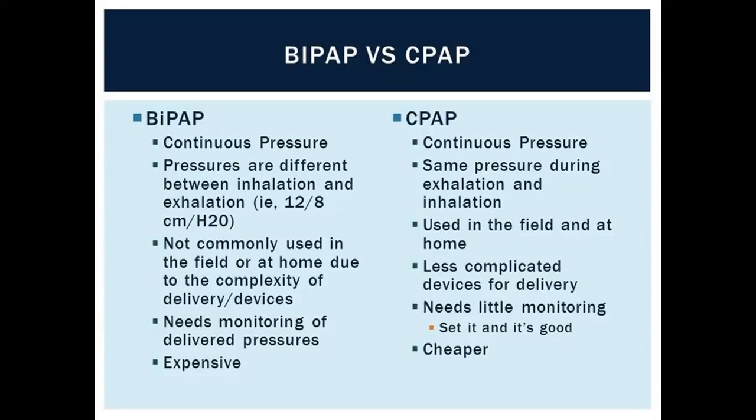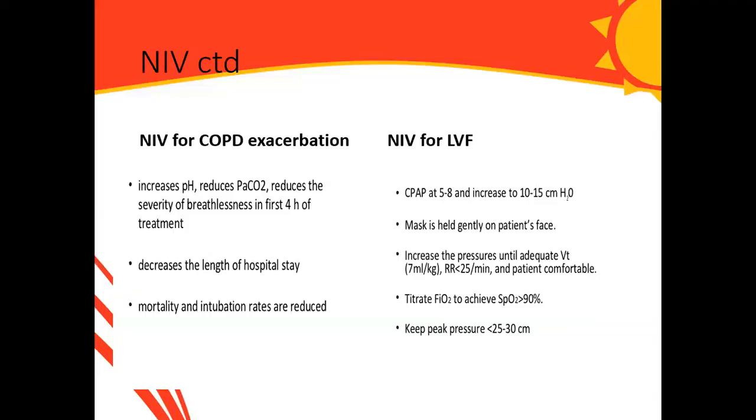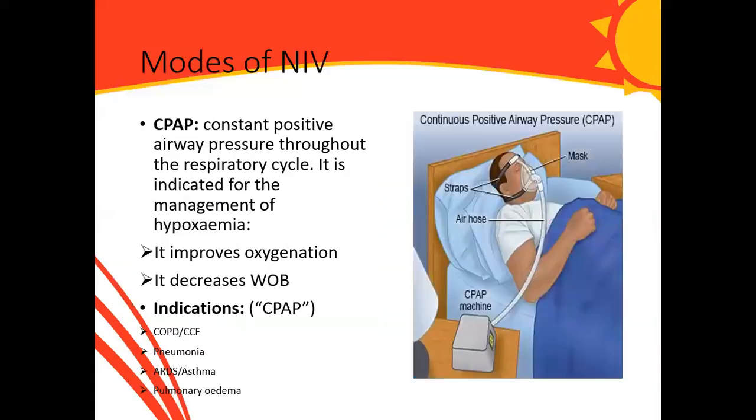For CPAP, it's a constant pressure that is delivered throughout expiration and inspiration. It's less complicated and can be used in the field or at home. It needs little monitoring. And this is the CPAP we saw with this patient.